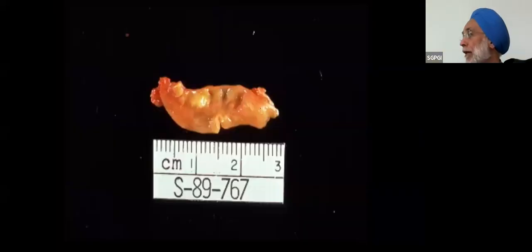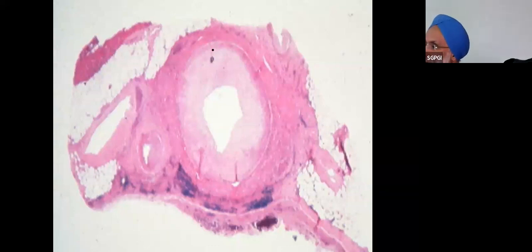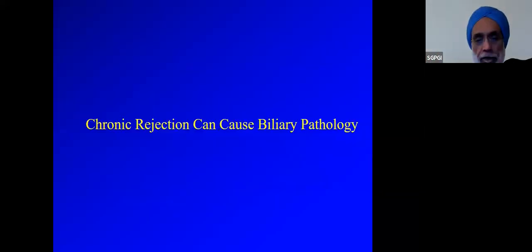And so the hallmark of chronic rejection in the arteries is graft atherosclerosis. So here's a graft which came out a long time ago. And these atheromatous plaques are actually quite similar to the atheromatous plaques you see in, let's say, native coronary artery disease. Coronary arteriosclerosis is eccentric, but graft arteriopathy is concentric because the immune system acts equally on all the sides. So that's one difference to be aware of.